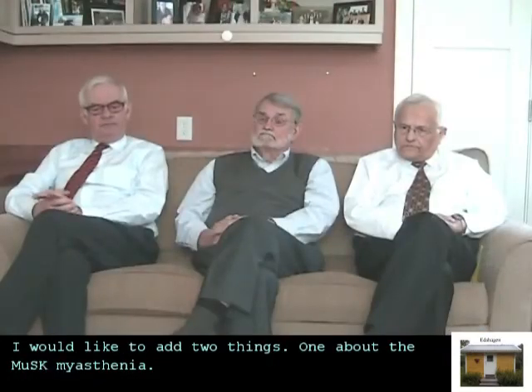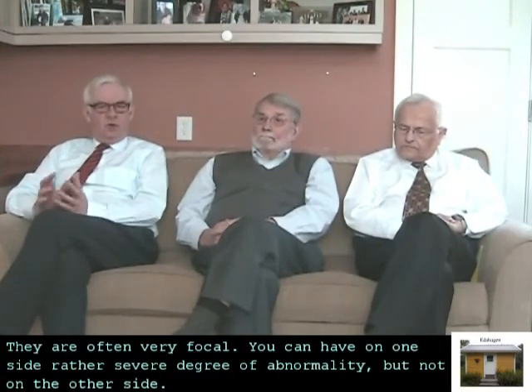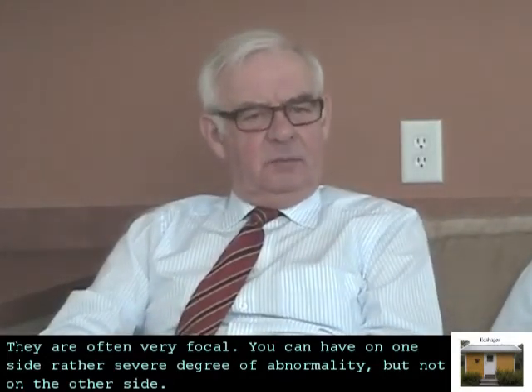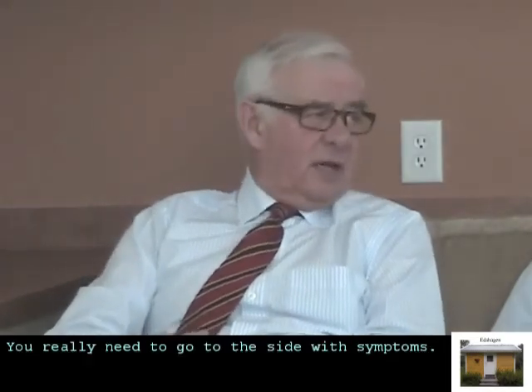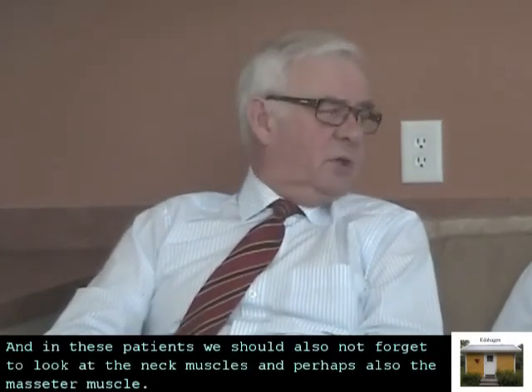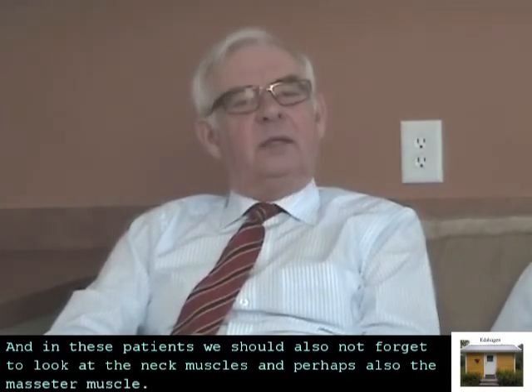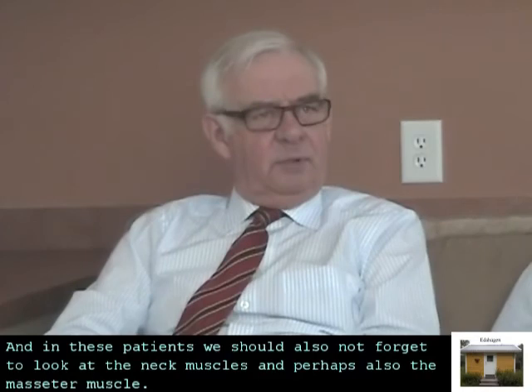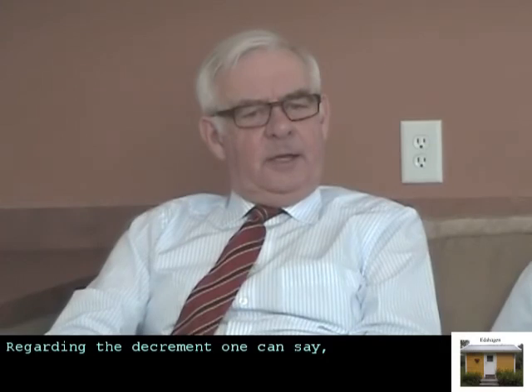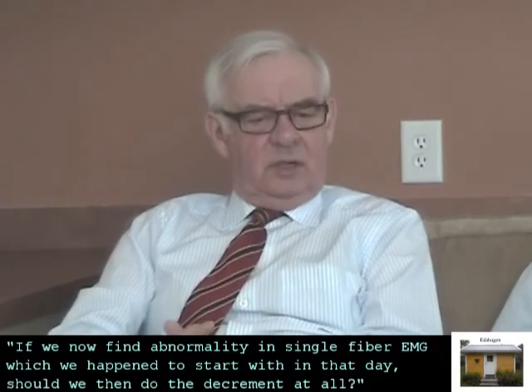I'd like to add two things. One about the MuSK myasthenia. They are often very focal. You can have on one side a rather severe degree of abnormality, but not on the other side. So I really agree with you to go to the side of the symptoms. And in this patient, we should also not forget to look at the neck muscles and perhaps also the masseter muscle.